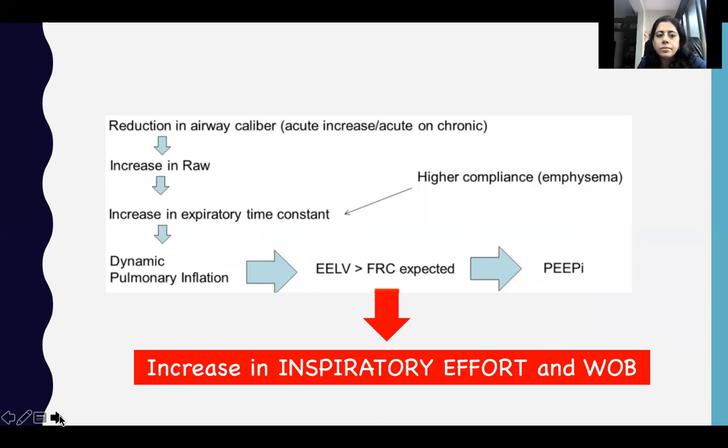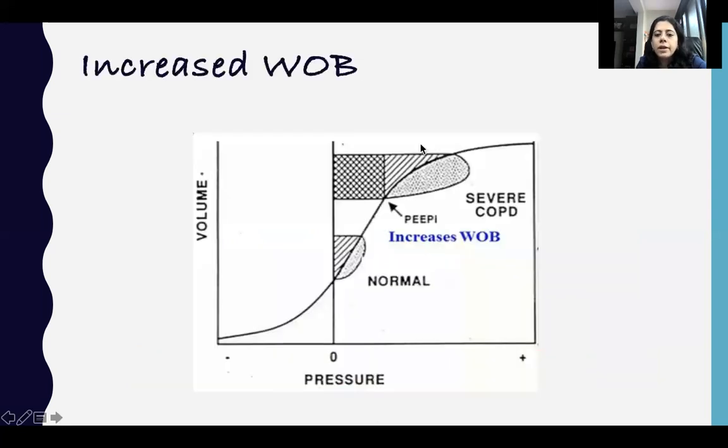So now to explain again, this is the place where our normal lung inflates. The amount of work of breathing, or the change in pressure that is required to change a tidal volume, is quite less.